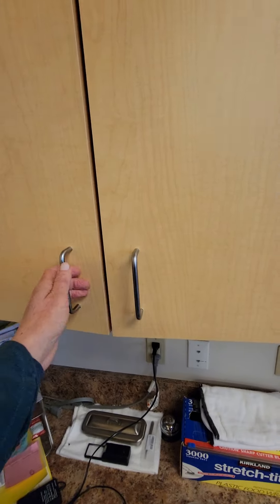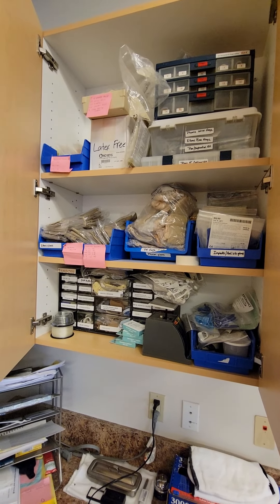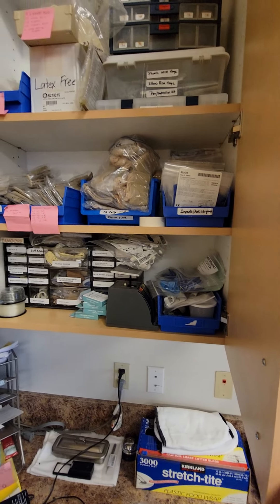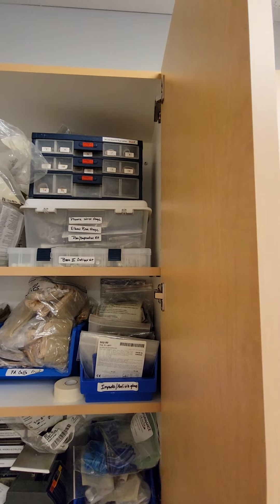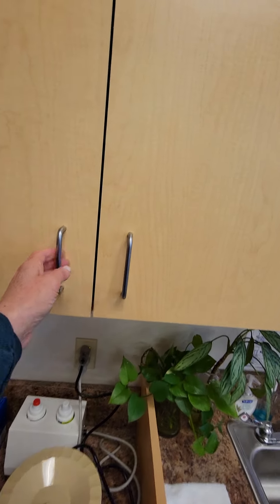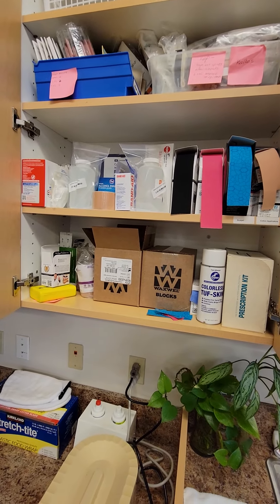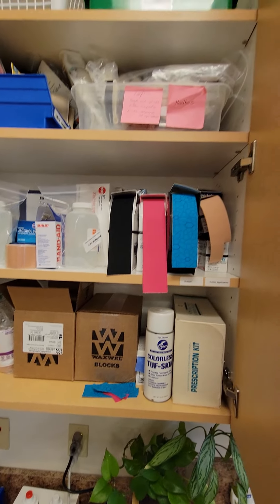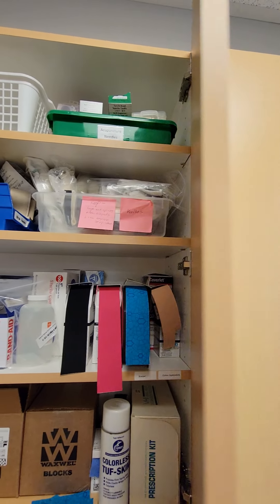This one in the corner will have some of your dynamic splinting components — isotoner glove, anti-vibration (those are pretty old). Some Coban is right there, just so you know. And the oval-8 aids. Again, some of this, if not most, is still here from when you were here last — it'd be fun for you to go through if you wanted to. K-tape, paraffin, wrist restore, and I think there's some Comfort Preen somewhere in there. Some heel bows up there.